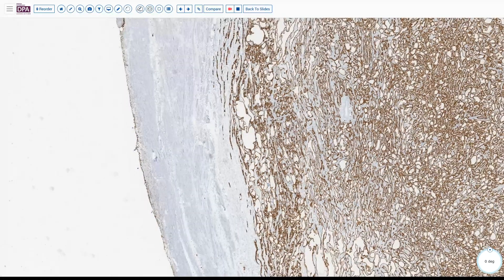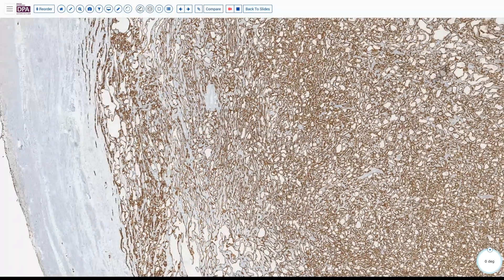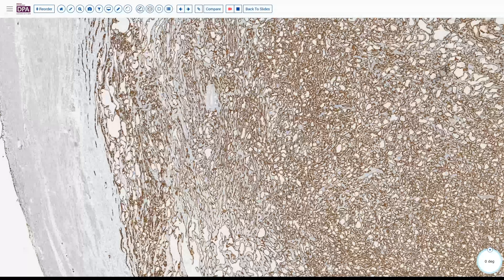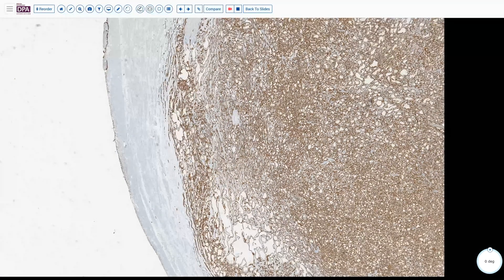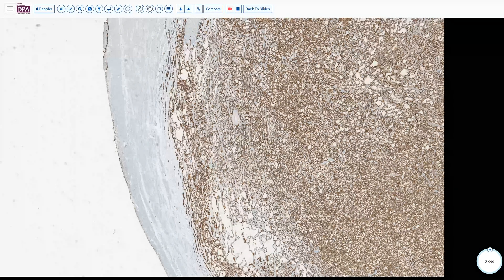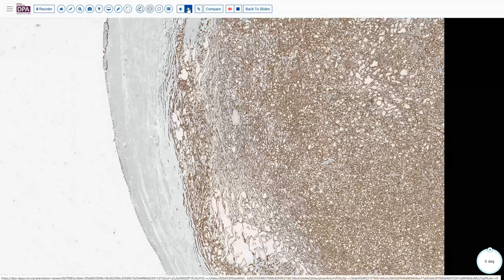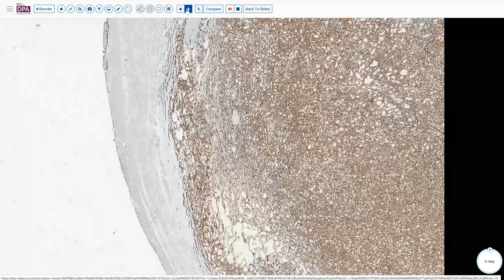This was a pancytokeratin stain, but similar results would be seen with mesothelial-specific stains like calretinin and a number of other stains as well, like CK5/6 and CK7. These tumors will also be WT1 positive, so if that's a consideration in ovarian cancer, you cannot use that as a discriminant.